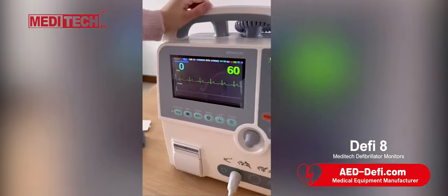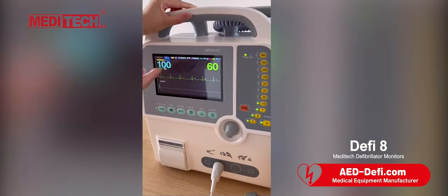For example, we press 100. You can see 100 here.